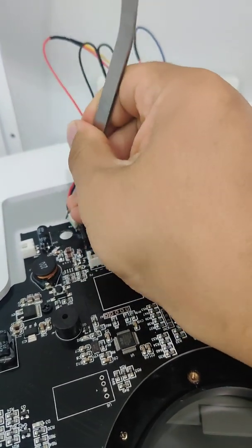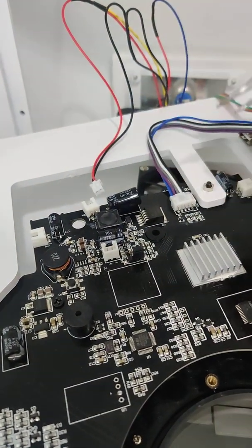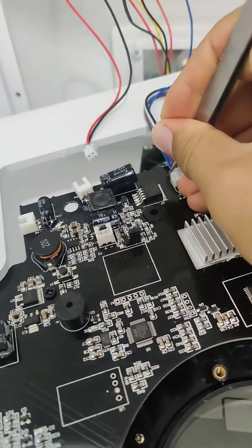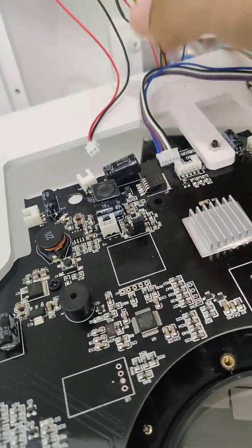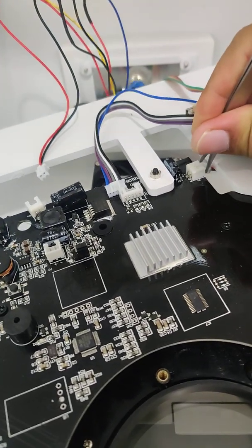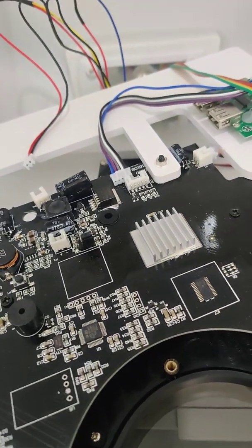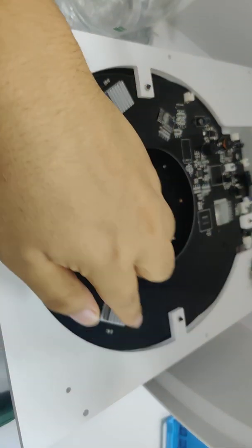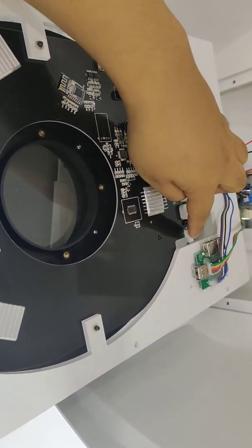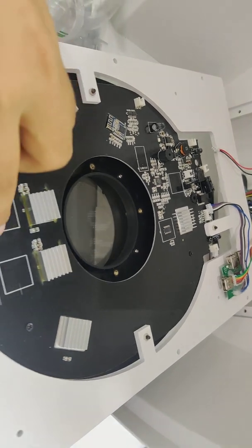Okay, we take off one, and then we take off this one. Okay, we can just pull it off. Okay, and this one we also need to take it off. Then we need to take off these 4 screws, this, and this. Okay, this cable cannot be taken off because it's stuck in here, so we need to take off these 4 screws.